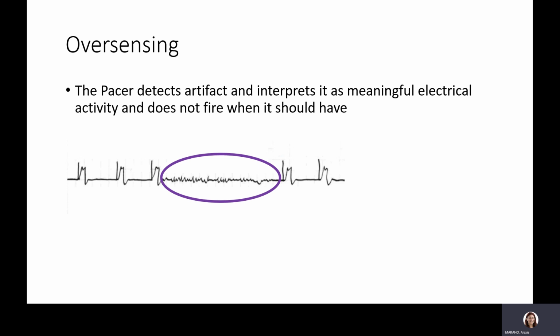That dishwashing activity is not really good, meaningful activity. It's actually going to be a little dangerous because she could be breaking dishes. She could be not washing them with soap, or maybe she's flooding the kitchen. Who knows? It's not going to be good, meaningful activity. So I'm oversensing that meaningful activity is happening, but it's really not happening, and it's really going to bite me in the end because I'm not having good, meaningful heartbeats, but there will be some sort of artifact in place.